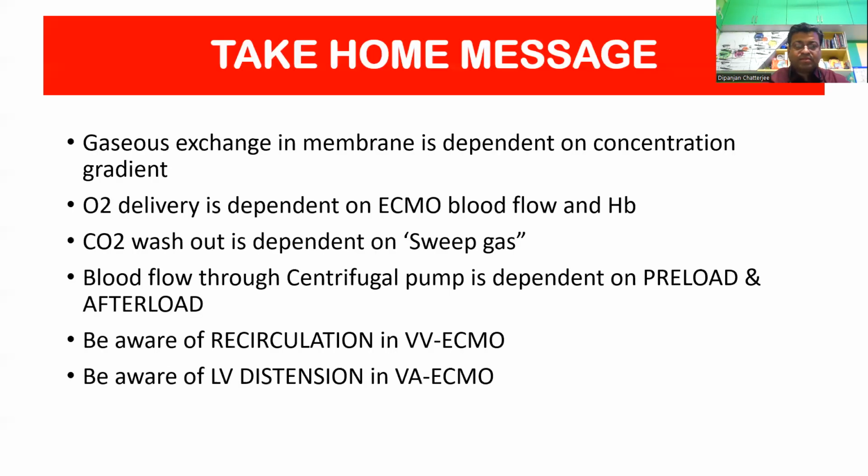Thank you. And these are the take-home messages. Always remember that the gaseous exchange is dependent on the concentration gradient, and the oxygen delivery is dependent on the ECMO blood flow and the hemoglobin. CO2 washout is dependent on the sweep gas. This ECMO pump is a centrifugal pump. It is dependent on the preload and afterload. The flow in the pump is dependent on preload and afterload. In VV ECMO, there can be recirculation. In VA ECMO, there can be LV distension.